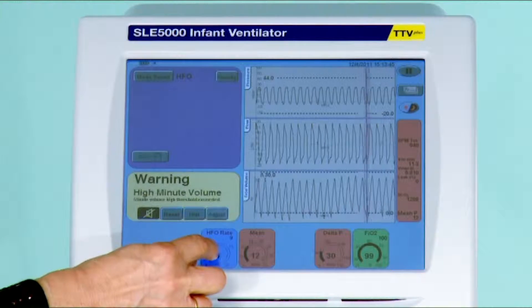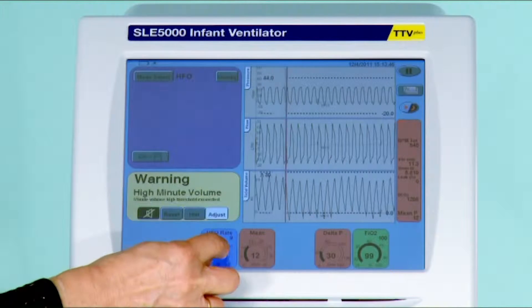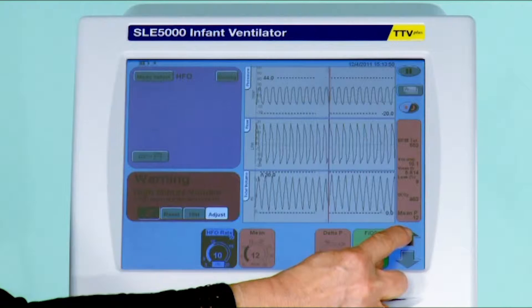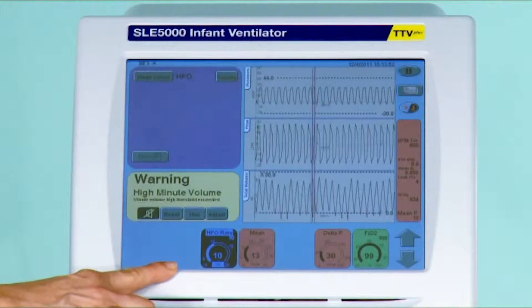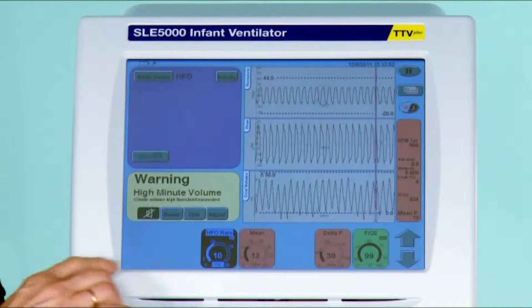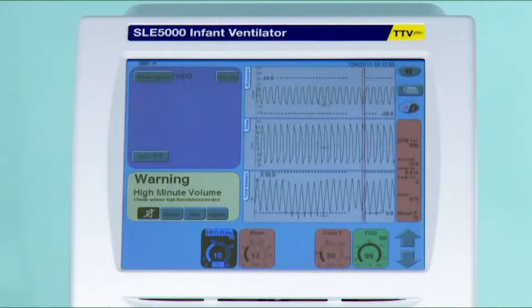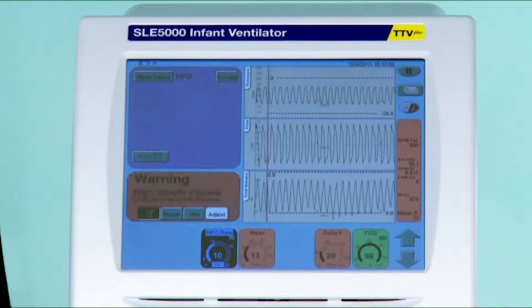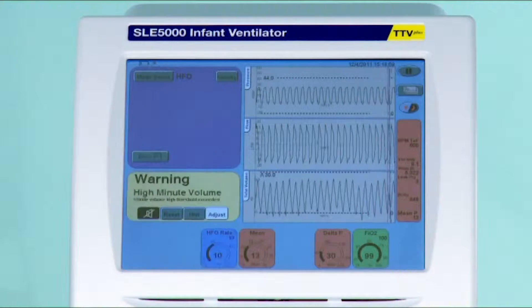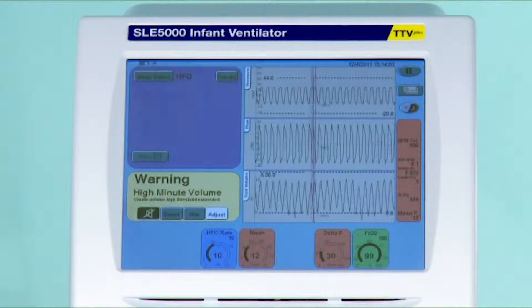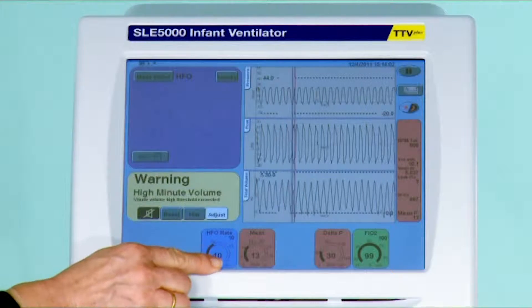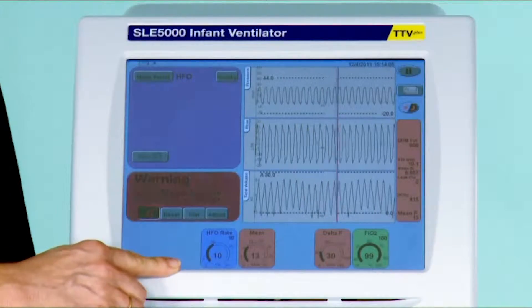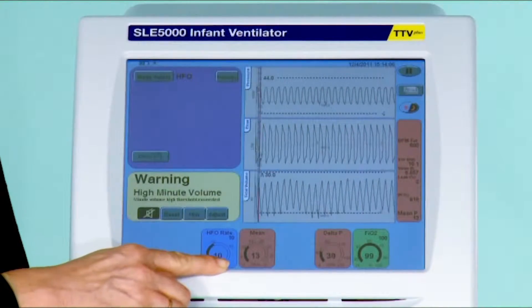As far as the rate is concerned, very often you will start at a rate of 10 hertz, which is the equivalent of 600 breaths per minute. A rate of 15 hertz is the equivalent of 900 breaths per minute, but there is no clinical evidence to go beyond 15 hertz.